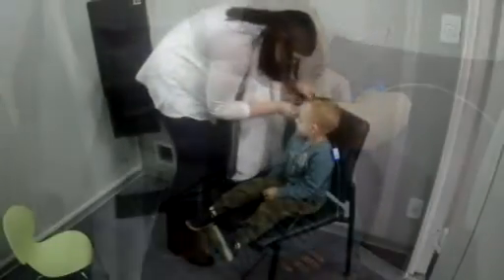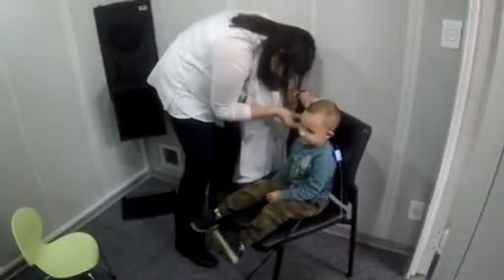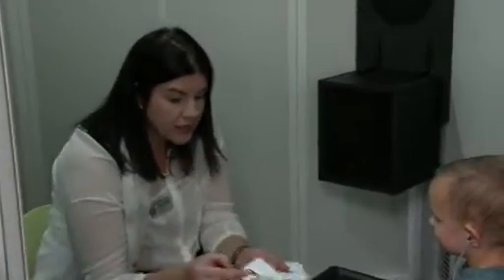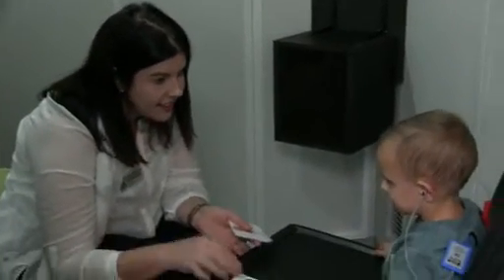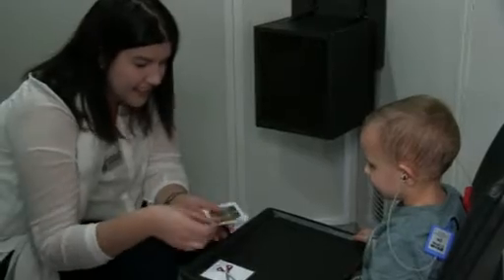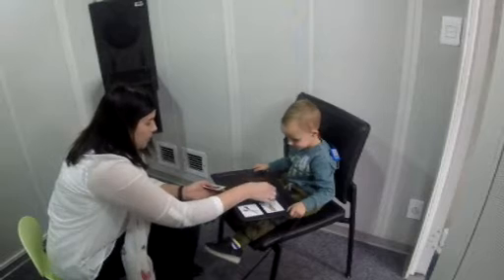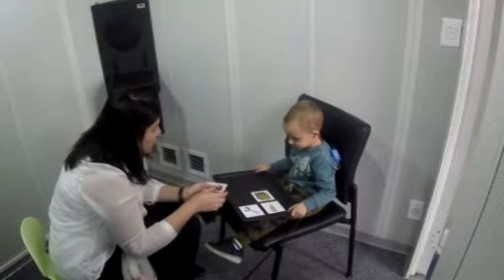The child will be positioned in a soundproof room with the insert earphones on the patient's ears. Make sure that the red earphone is placed on the right ear and the blue earphone on the left ear. The audiologist should determine the amount of minimal pairs that will be used during the test according to the patient's developmental level. The assisting audiologist should be facing the child and introduce and present each minimal pair to the child.